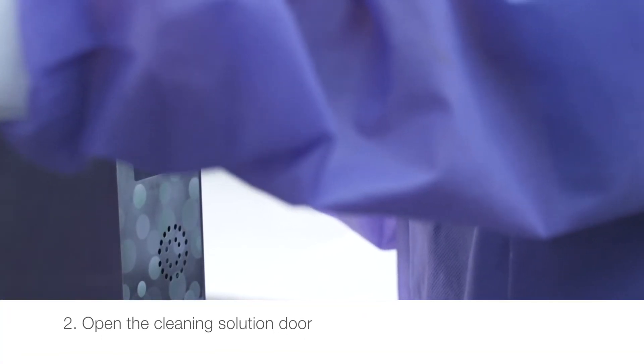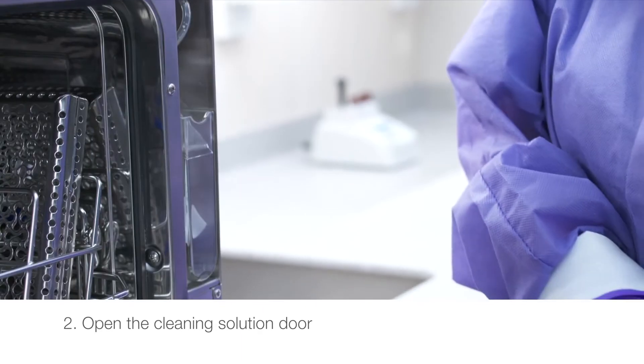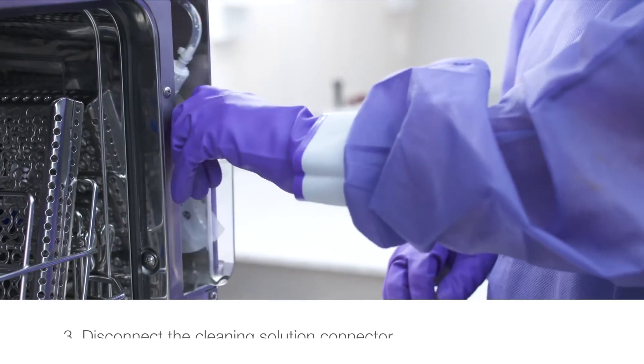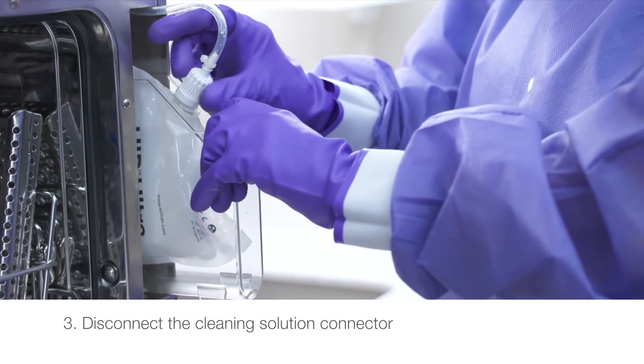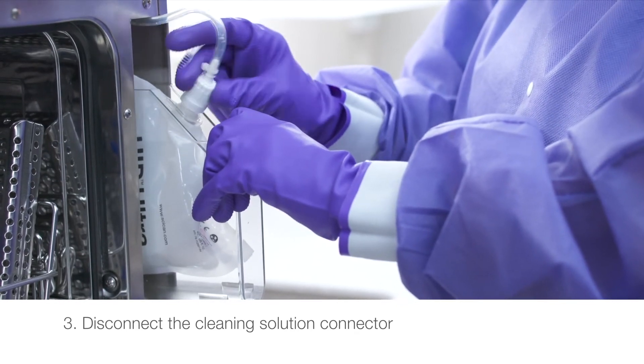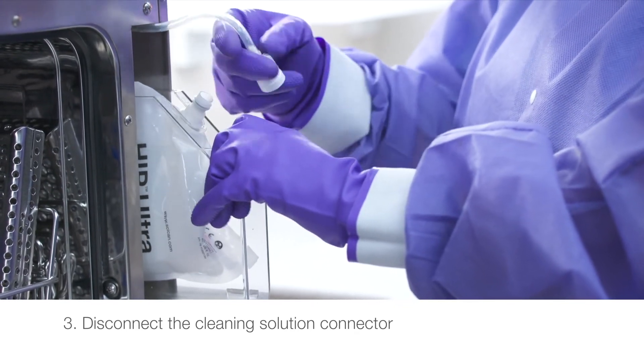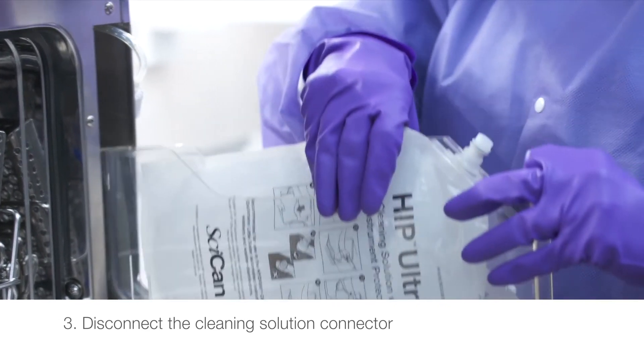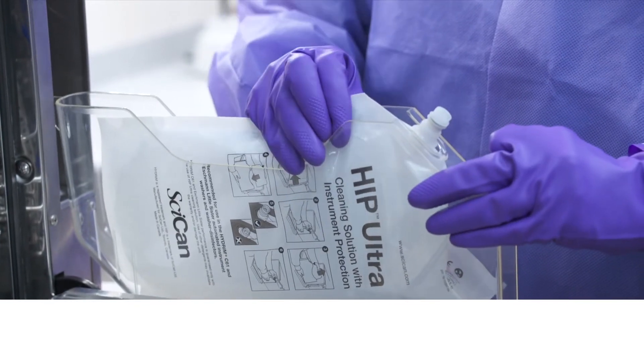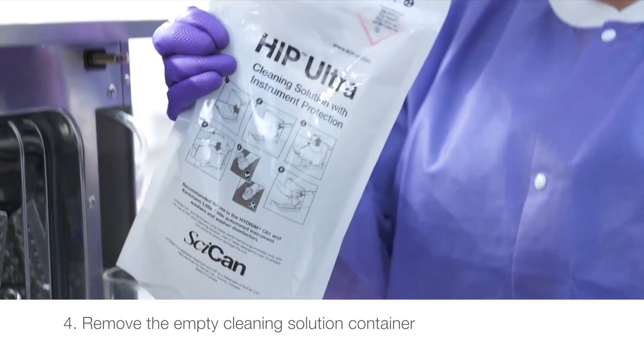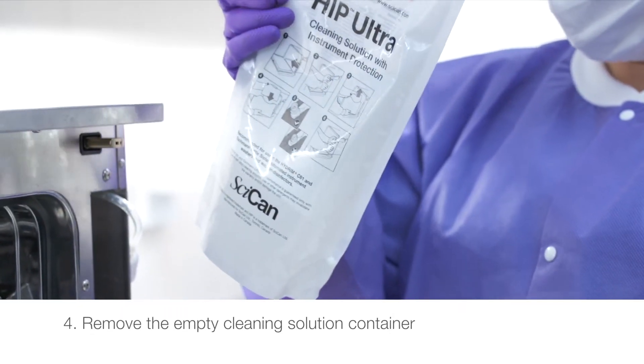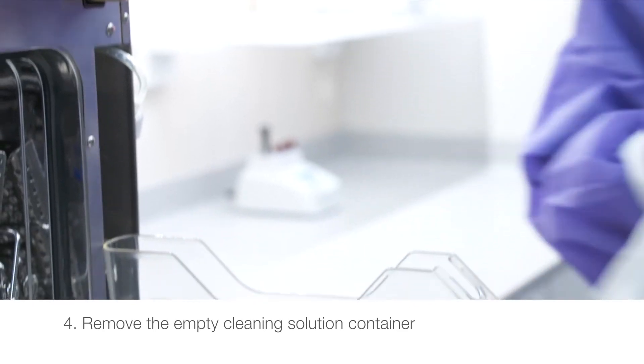Open the cleaning solution door. Disconnect the cleaning solution connector. Remove any dried chemical by immersing the connector in a cup of water. Remove the empty cleaning solution container and discard or recycle.